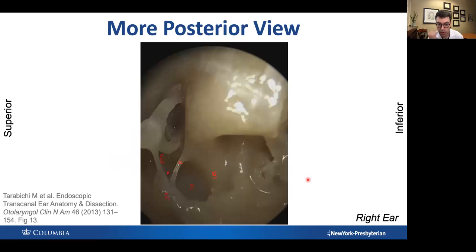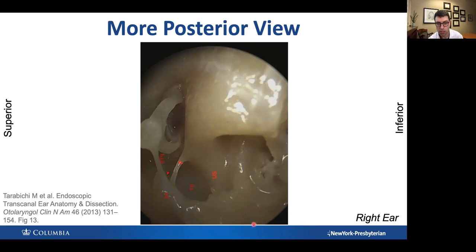Let's look again — now going more posterior. For reference: promontory, stapes, capitulum, stapedius tendon coming out of the pyramidal eminence. The ponticulus is really obvious right over here. This is the subiculum right over here — it comes out of the superior part of the round window overhang. And here is our sinus tympani, very obvious.